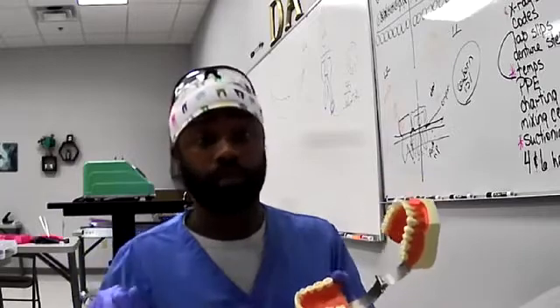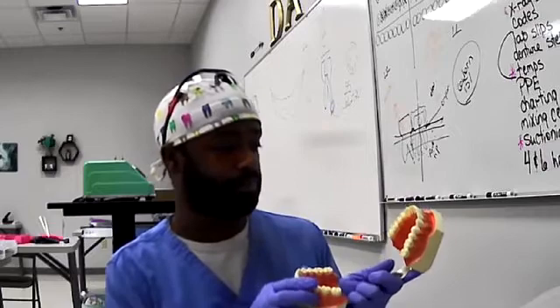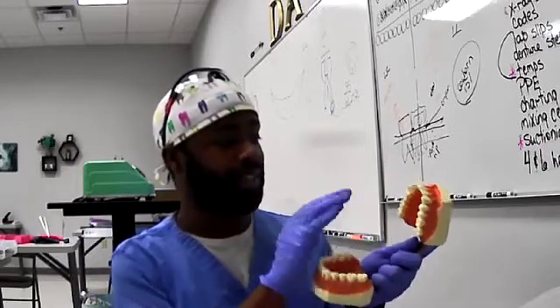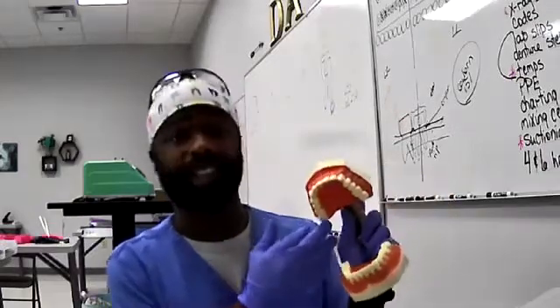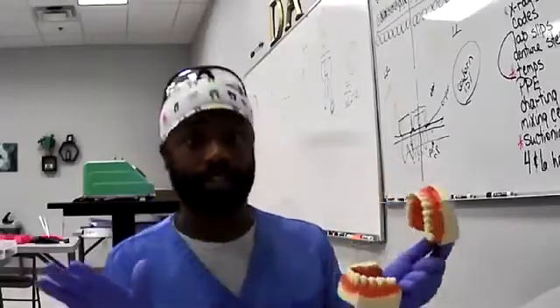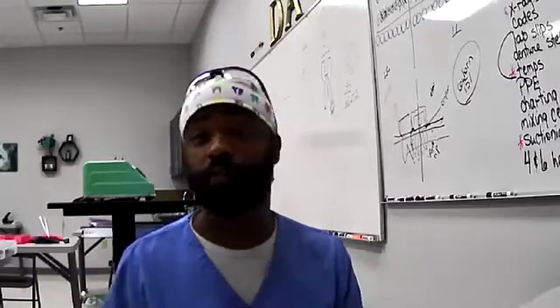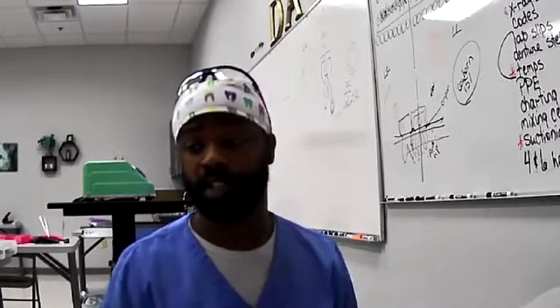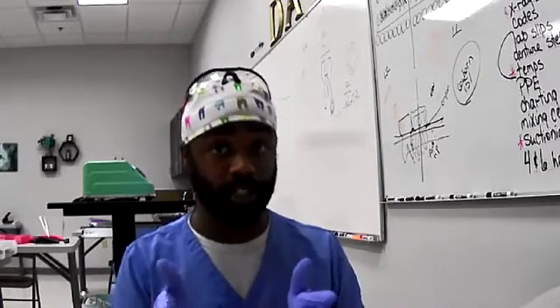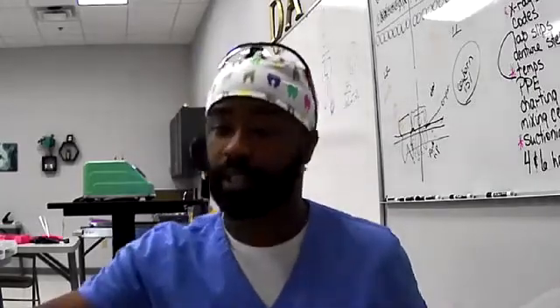You don't want to adjust the whole tooth because you're going to keep doing it over and over if that's the case. So just adjust the spots that were marked, and only adjust the deep spots that are marked, which I'll show you tomorrow too. Don't worry about that. If you feel like you've adjusted too much off, or you're about to adjust too much off, just leave it alone. Let your dentist adjust it. Don't let that freak you out at all. That is something that your dentist can do too.